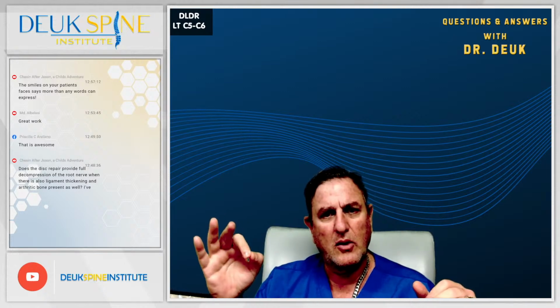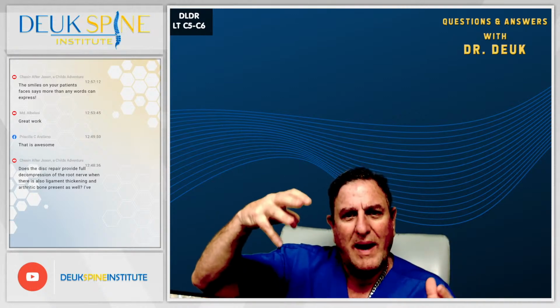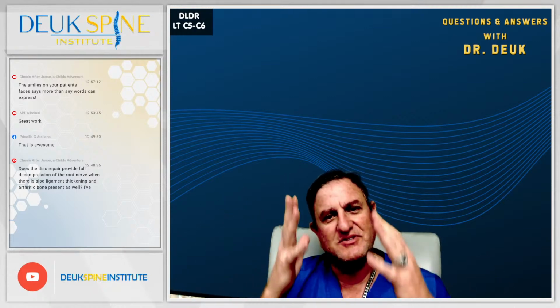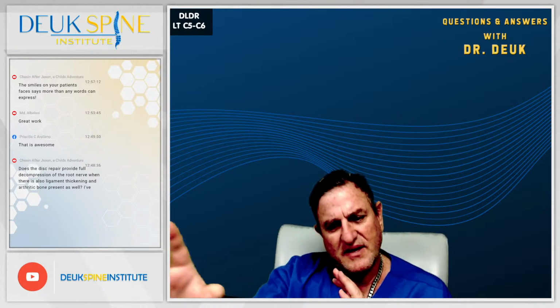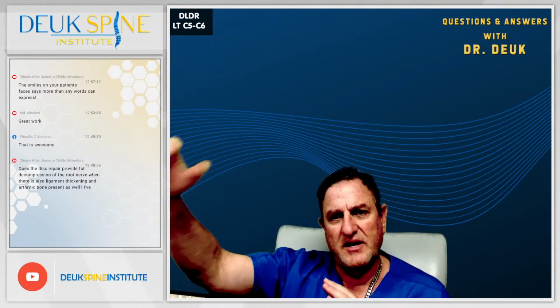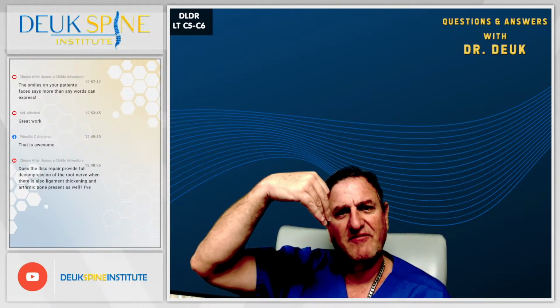We got it all cleaned out, and what was really cool, if you go back and look, near the end, I kind of looked to the right side, and you could see that beautiful white stuff. That's normal nucleus and normal annulus. When I say right side, it was the right side of the scope, which is really the left side of his disc. It was really the right side of his disc from about the middle over where there was a giant tear. And if you go back and look at the discogram at the beginning, you can see the dye leaking out through the tear on the right side. Big tear on the AP view, front back view on the right side.